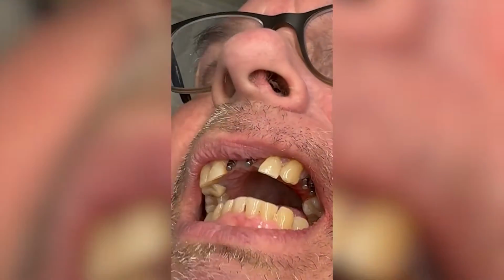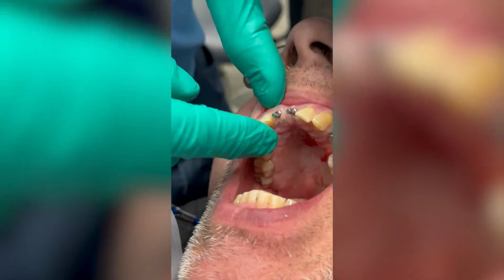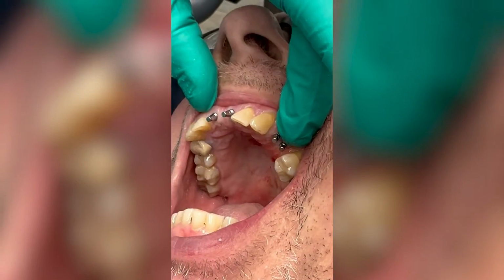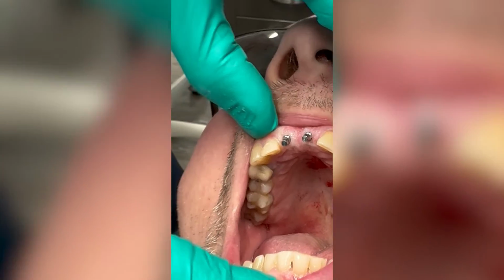Okay, let's take our impressions. So now you've seen me place 4 3.0 by 13 millimeter mono implants in number 8, 9, 12, and 13 in a matter of minutes. And we're going to take our final impressions and make some temporaries.